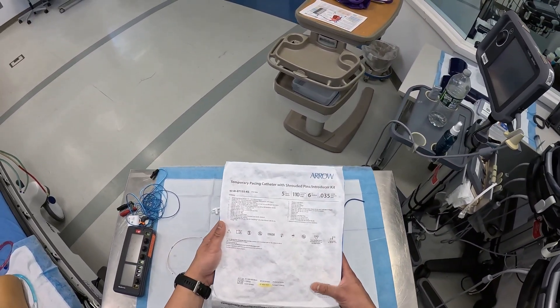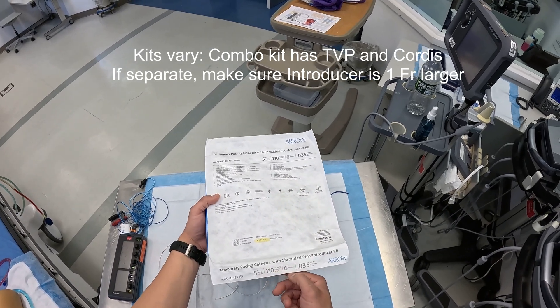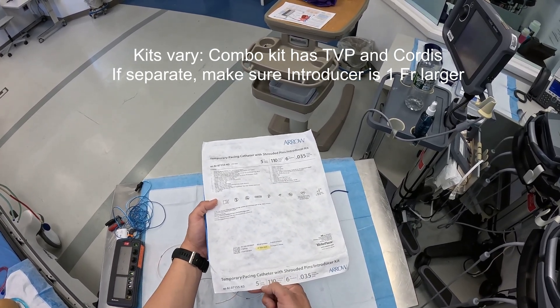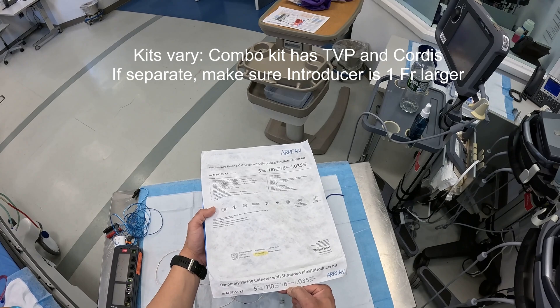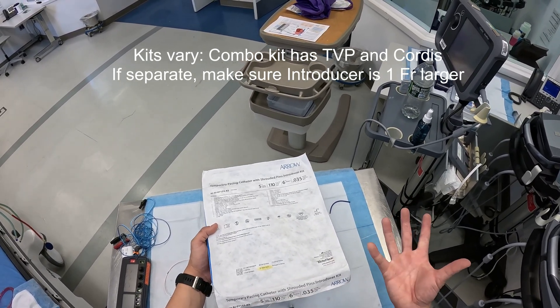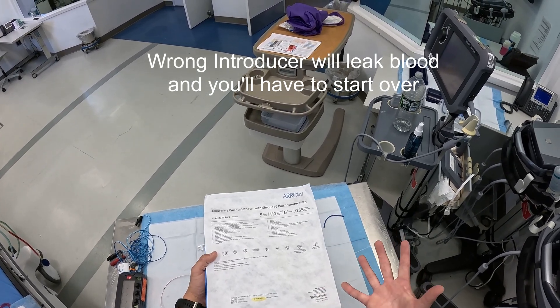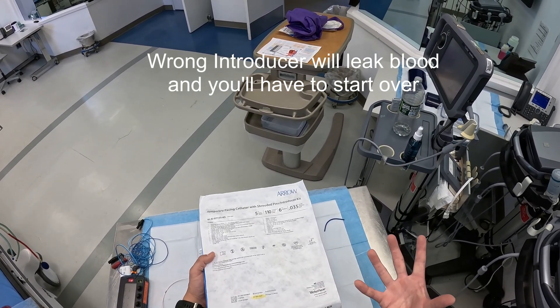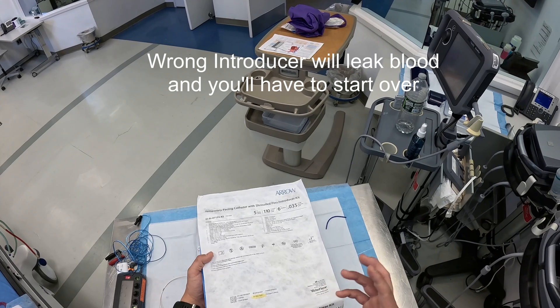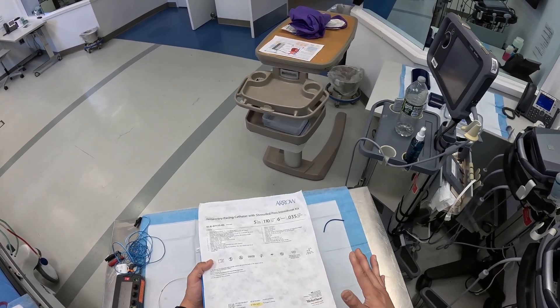First off, we have a temporary pacing catheter — this is the all-in-one box. It's going to contain the cordis, which is six French, as well as our catheter, which is five. We want to make sure that the cordis we use is only one size larger, or else we'll have blood leaking around the pacing catheter. You sometimes might make the mistake of pulling a cordis for massive transfusion protocol — that cordis is usually an eight or nine French, and that's the wrong cordis to use. So make sure you're using the right one for this.